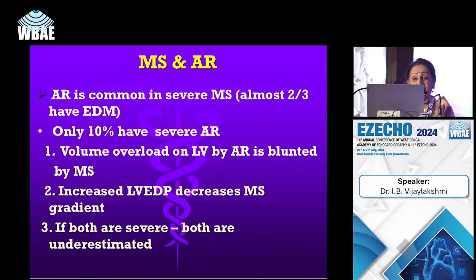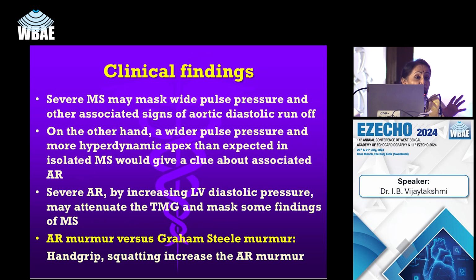The thickening is there, submitral fusion, and especially when you insert the balloon, you can see that the distal portion gets deformed, because it is caught in the chordae. For this, what we do is we put a peripheral balloon, dilate the papillary muscle and submitral structures first, and then do the balloon dilatation.